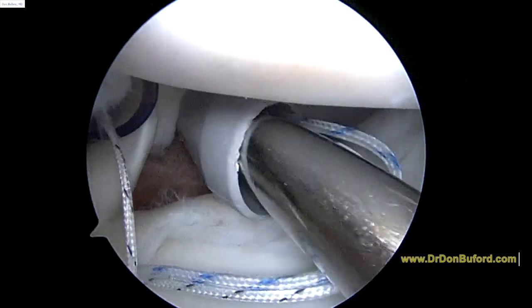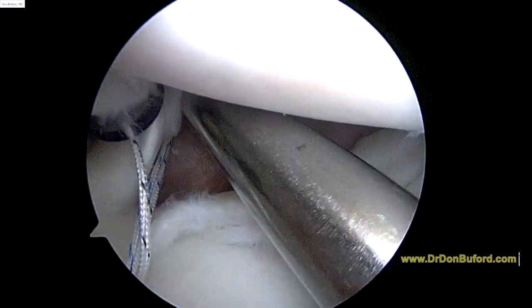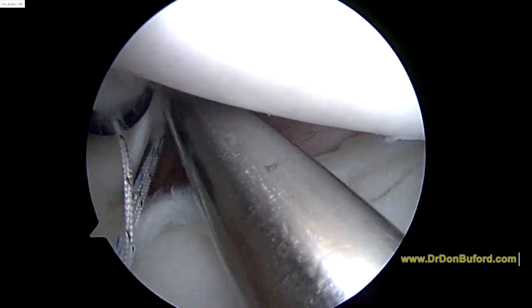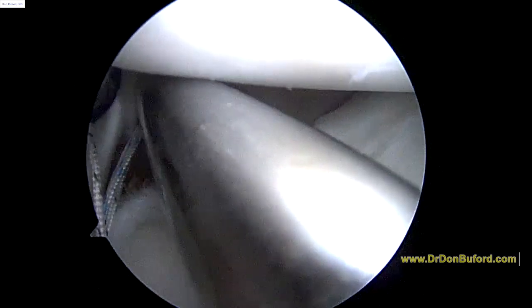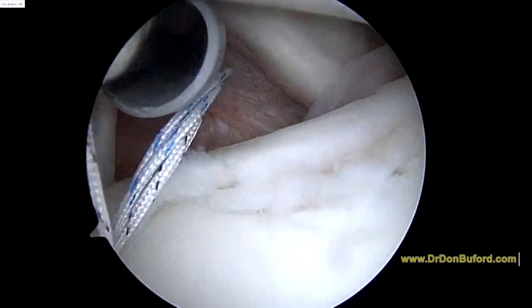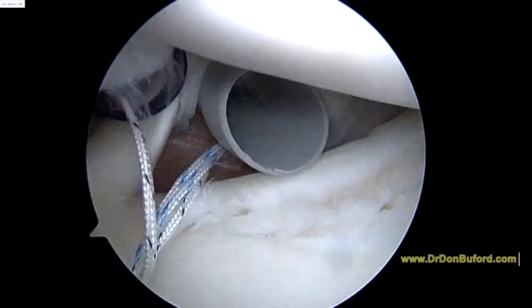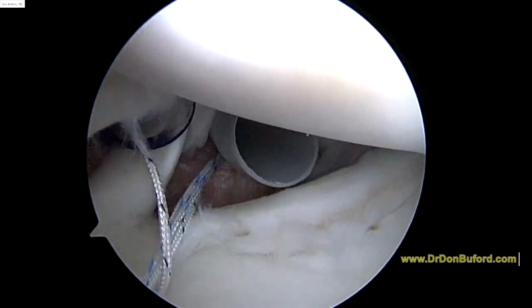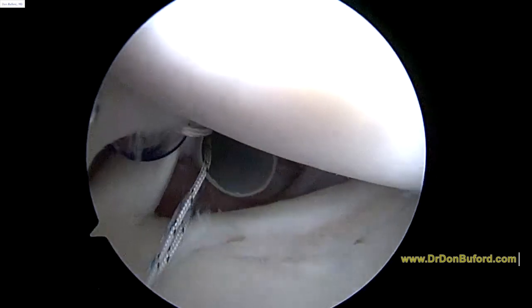Okay, now back out the cannula. All the way out. Did you get the suture out? Mm-hmm. I'll pull the suture. Okay. And now you can see those sutures are outside the cannula, which is what we want. Now we're going to hold the cannula right there. We'll take a crochet hook, and we'll take the one suture that we're going to work with first, so it's inside the cannula, just like that.